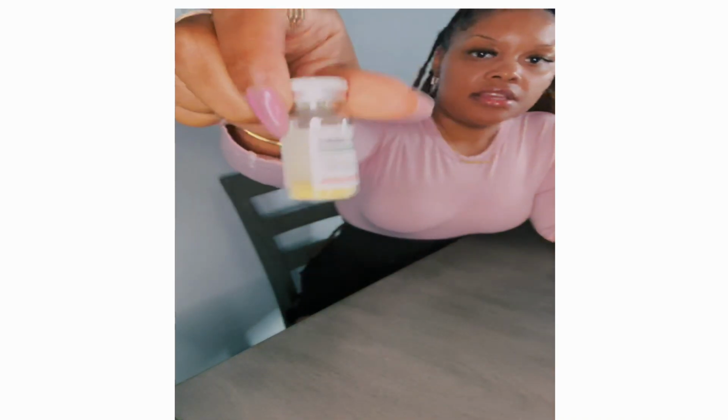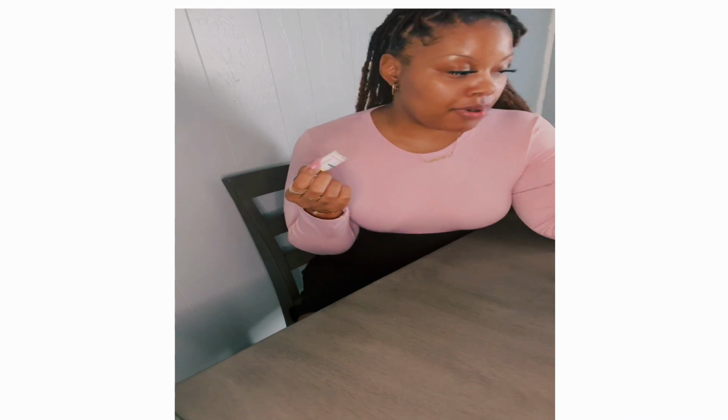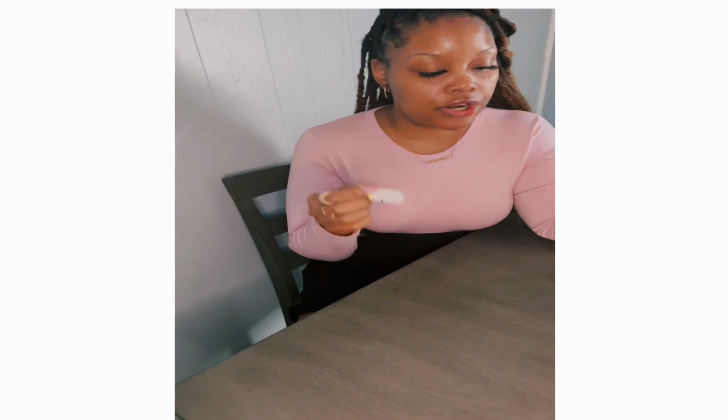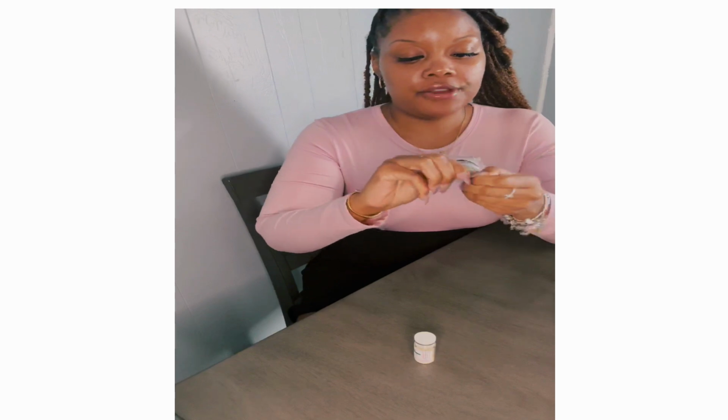It's going to come as this powdered solution. So you see it? It's powder. All right, so from reading the problem, you know what you need to dilute with. So you don't want to automatically assume that you're going to use sterile water. You want to read it, because sometimes you use dextrose. Sometimes you use normal saline. So you want to make sure that you read your problem. So we read our problem, and our problem said that we're going to dilute it with 2.2 mLs of sterile water. So I have my sterile water right here.